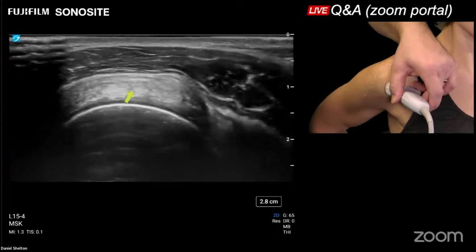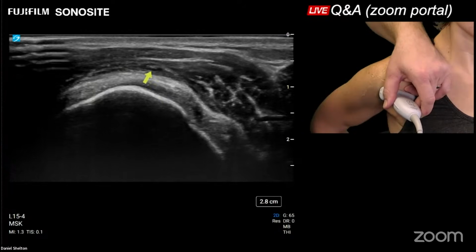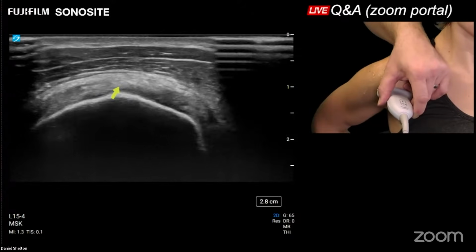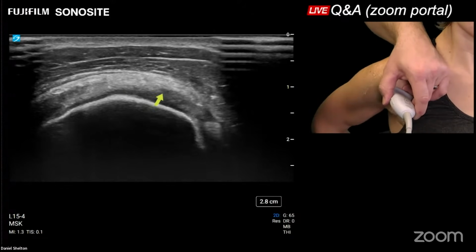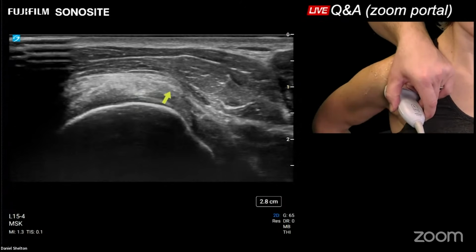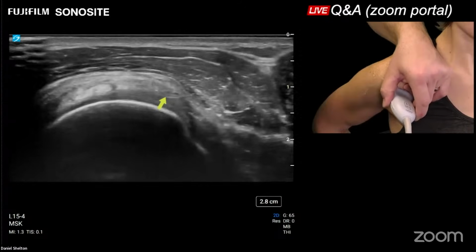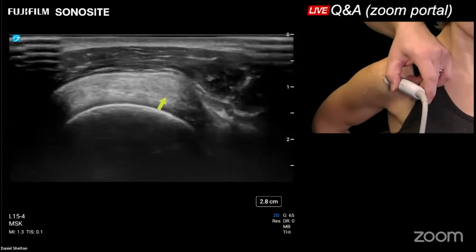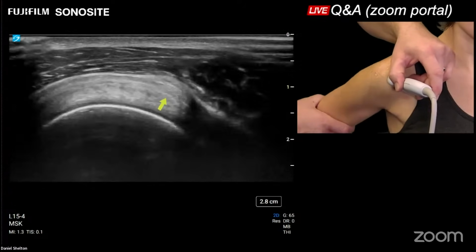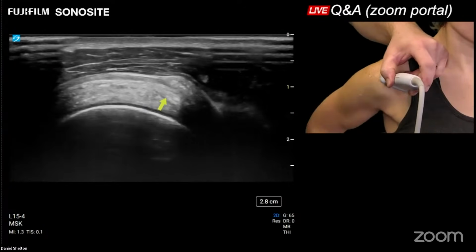And then this middle third, as we go distally and see the superior facet meet the middle facet, that's where you share a conjoined portion of the tendon of the infraspinatus and the supraspinatus. So infraspinatus fibers more or less overlap your supraspinatus fibers, and your supraspinatus fibers tuck under your infraspinatus fibers, and the anterior-most shadow that you're seeing right here is coracohumeral ligament right there where my arrow is. So after you assess for volume loss, you can even wag the elbow a little and look for bursal adhesions. I don't see anything clicking, popping, snapping, dragging, which is really nice.